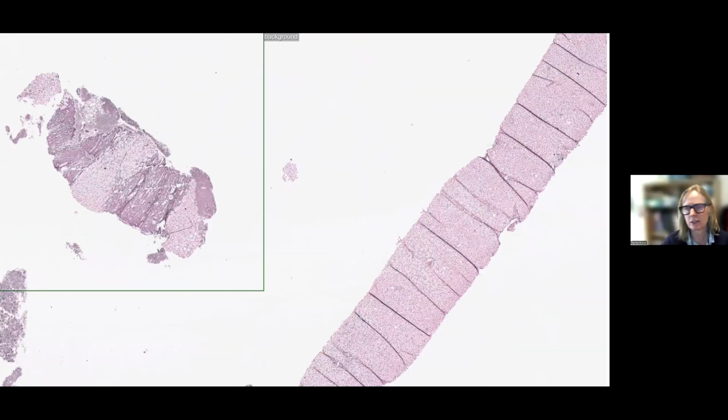And I think that's because, in fact, the majority of this tissue was lesional. There's only a tiny bit of background liver. So I would suggest that this is background liver here. It's very hard to know, but we might be looking at a cirrhotic nodule there. We can't say for certain. I think we've got some lesion here, and the rest of the tissue is lesional. And even at this power, do you start to get the feeling that there is less reticulin here?